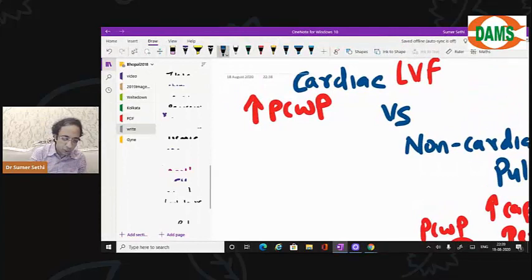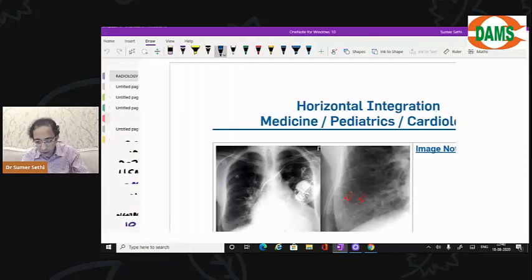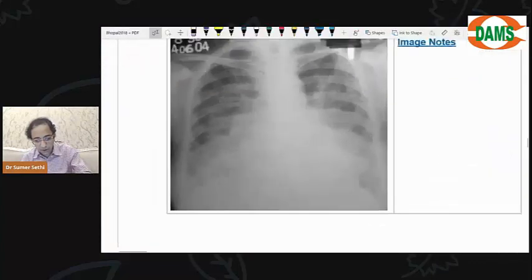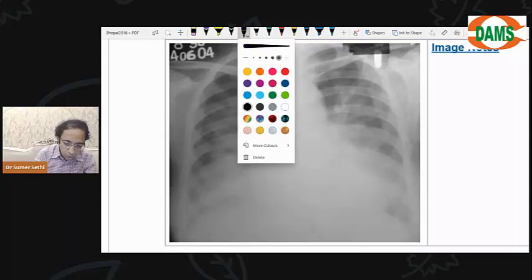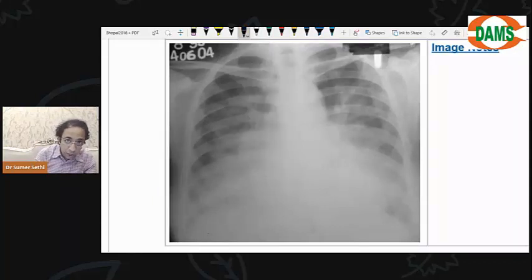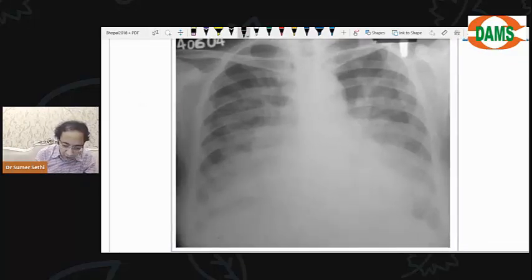Very good. Now we come back. Okay. Now let us summarize everything with an example. Let's look at some X-rays first. Okay, let's try and look at our X-ray here. Because the key is not to run, the key is to go slow and get to the idea. Okay, listen to me. Everybody try and understand.